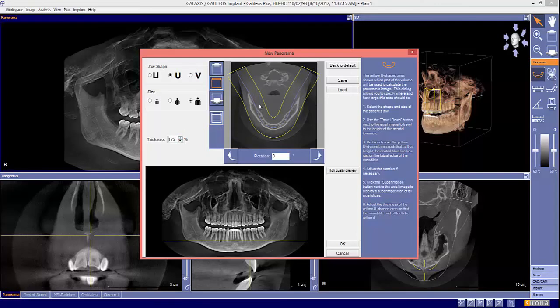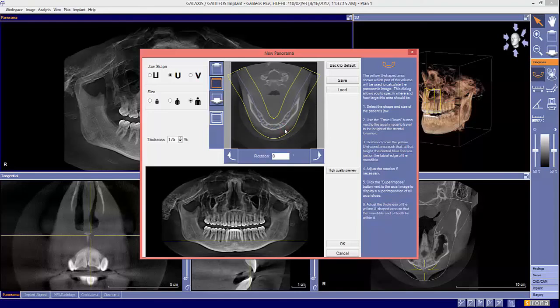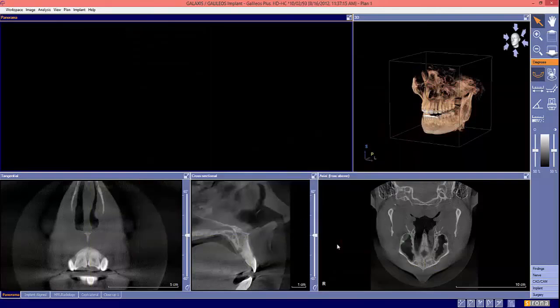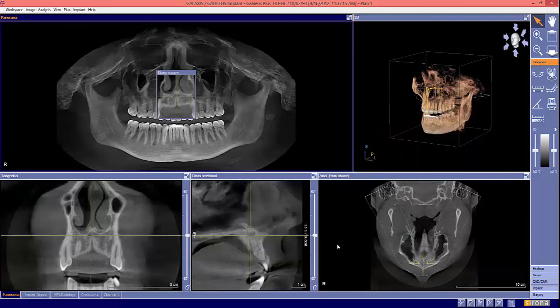Once you get the pano looking the way you like it, select save, then OK. Now you're done optimizing the pano.